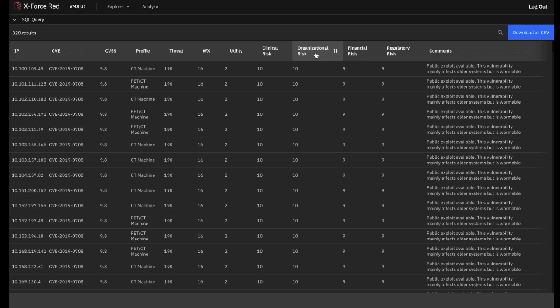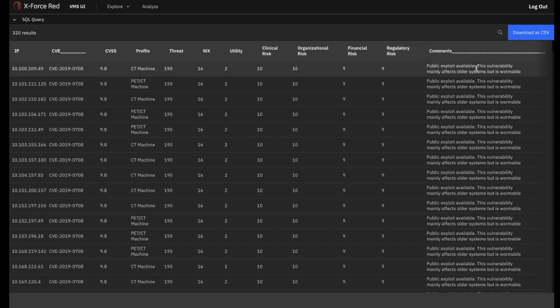Imagine what would happen to patient flow from the emergency room if the CT machine we had highlighted earlier was rendered unavailable. Financial risk represents the severity of recovery costs, potential regulatory costs, and revenue losses that could occur if a vulnerability is exploited. Regulatory risk captures the severity of intervention that could happen from regulators if a vulnerability is exploited, causing disruption within an organization. It is also a marker of reputational damage. Finally, we have some descriptive commentary from a technical perspective about each vulnerability.